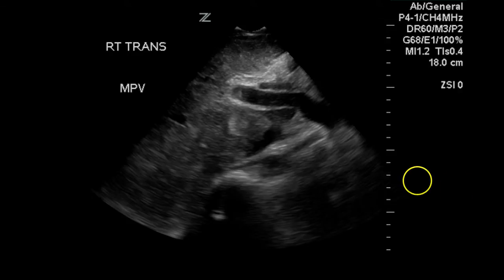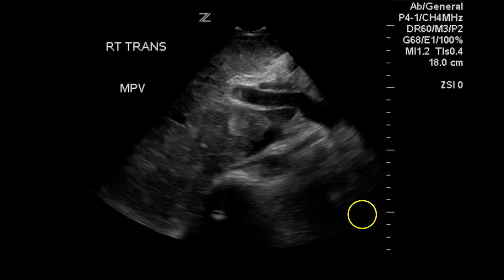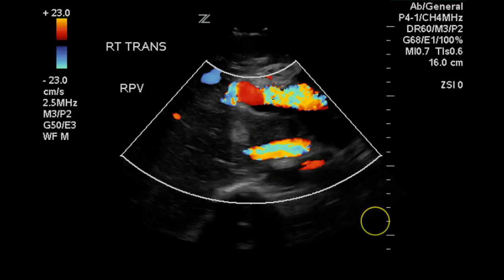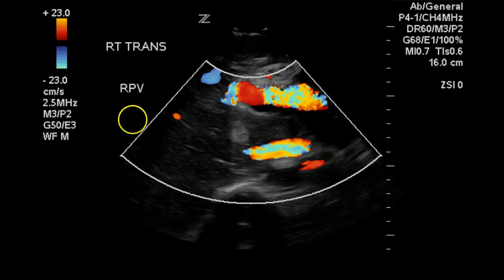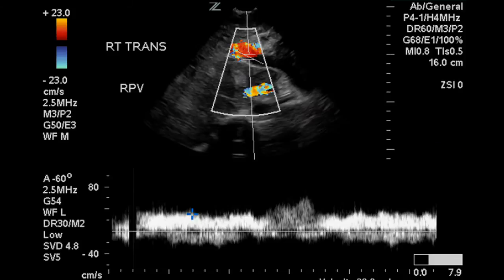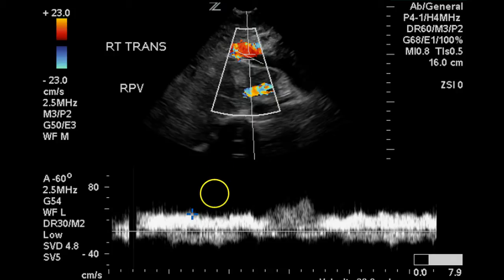Here we have an image of the main portal vein entering the liver. In this image, the right portal vein is filling with color. The scale is rather low and it is hard to tell because of aliasing what the direction of flow is, but on this image the flow should be toward the top of the screen, and it is.